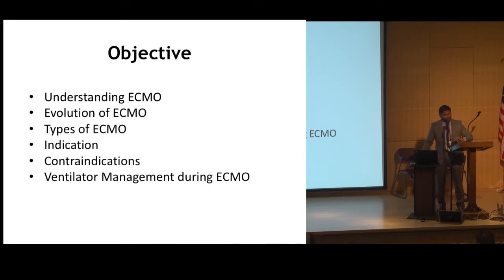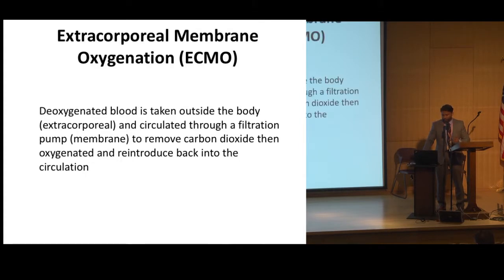So we have another presentation for individuals who are in a role where they are respiratory therapists working in a perfusion setting, or a perfusionist who needs to understand a lot more on how ventilators interact with ECMO machines. We have another presentation on that where we go very in detail and in depth. So that's not the lecture today, but it's going to give you a basic overview of what ECMO is. ECMO pretty much stands for extracorporeal membrane oxygenation.